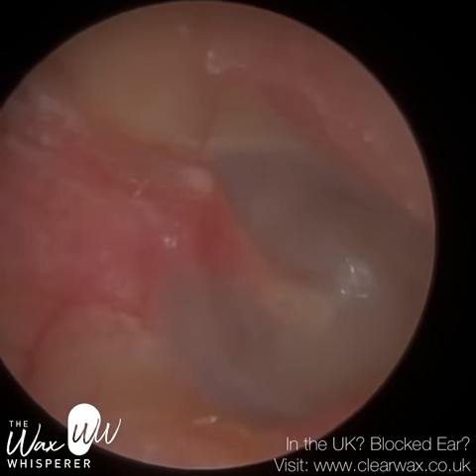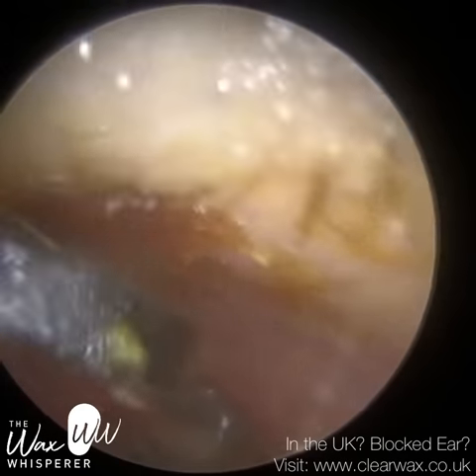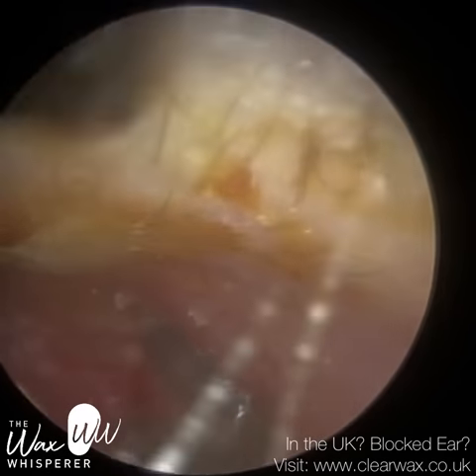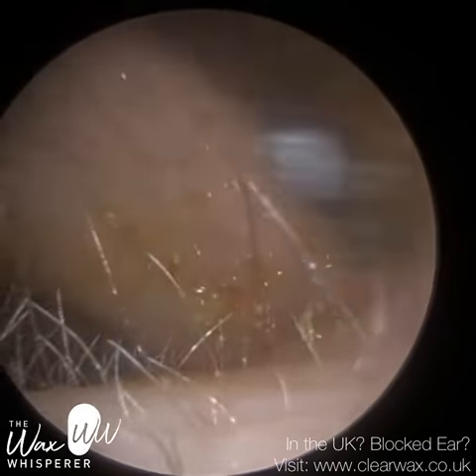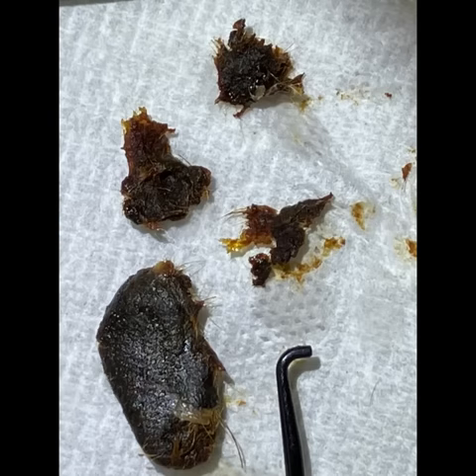That's the patient's eardrum — nice and healthy. I suspect the wax plug was attached to the back part of the ear canal because it's a bit red there, so probably a few skin adhesions, and that's another potential cause for the slight discomfort the patient experienced. Just some sticky wax at the entrance of the ear canal — just going to mop that up. And we're going to have one final look at the eardrum again. You can see the blood vessels are slightly dilated, so I suspect the wax plug was attached to the canal wall in that region.